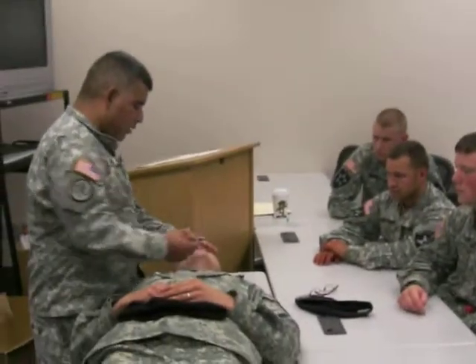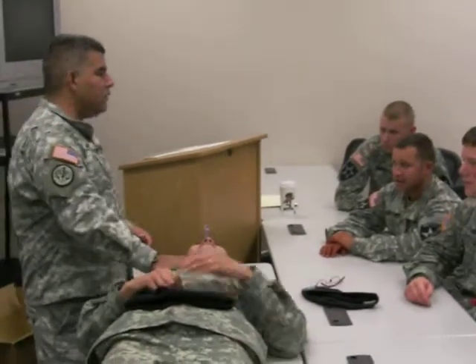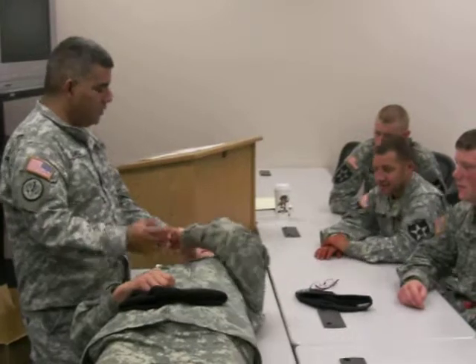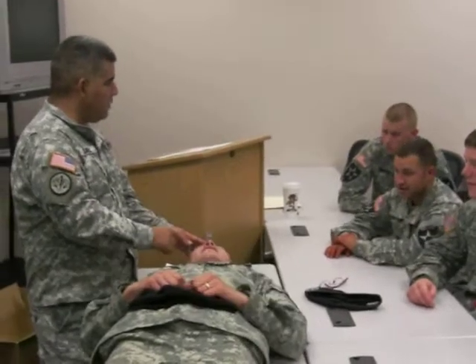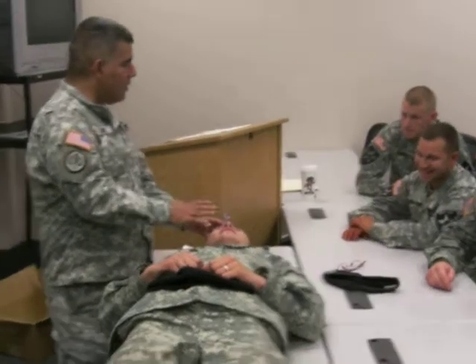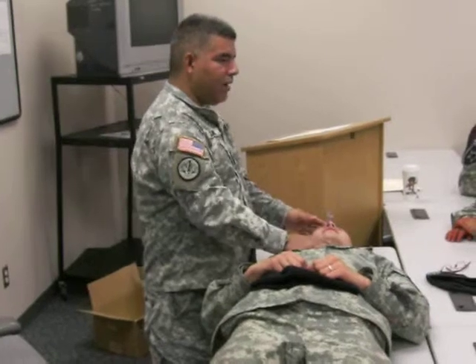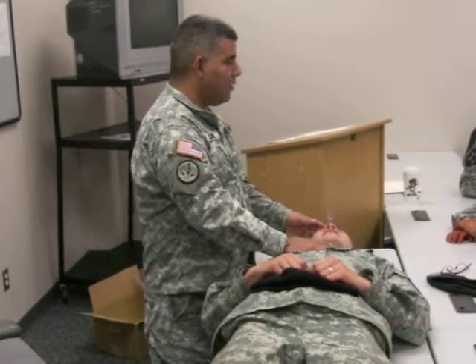All right. We're going to assume it goes all the way. What you want to actually do is insert it all the way. I'm not going to force it into his nose. What you would actually do is put it in so it goes all the way to the base of this flange right here and rests all the way. Since right now it doesn't go in, I would actually take it out and try on the other side, okay? But we're causing him a little bit of pain, so I'm not going to go ahead and do that, okay?